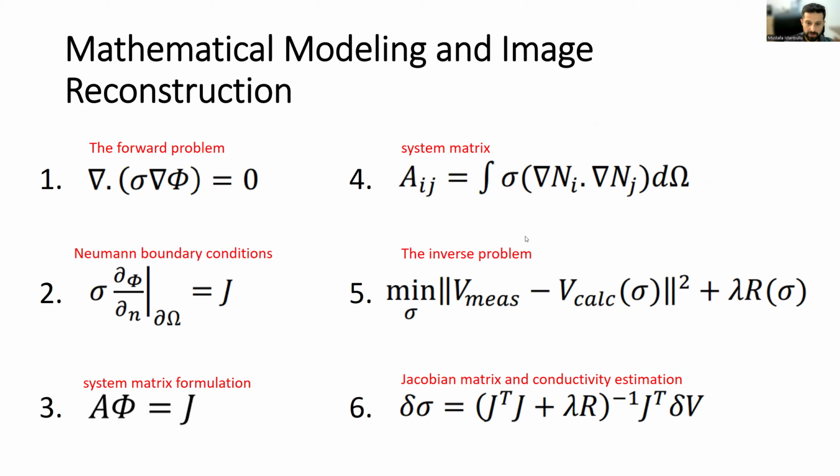The inverse problem aims to reconstruct the internal conductivity distribution by analyzing the measured voltage data. This is achieved by minimizing the difference between the predicted and observed voltages. The reconstruction process employs a Gauss-Newton method combined with regularization techniques to enhance the image stability.